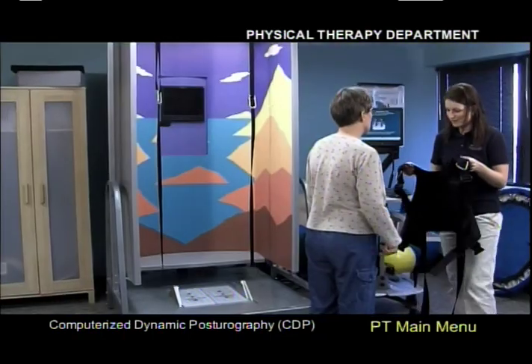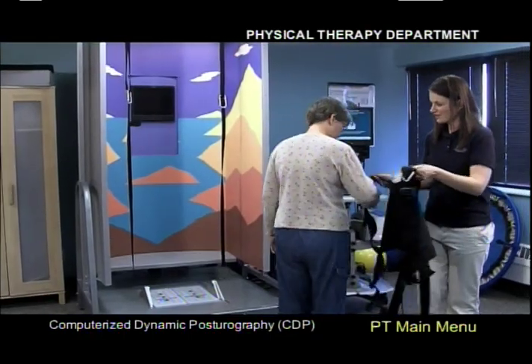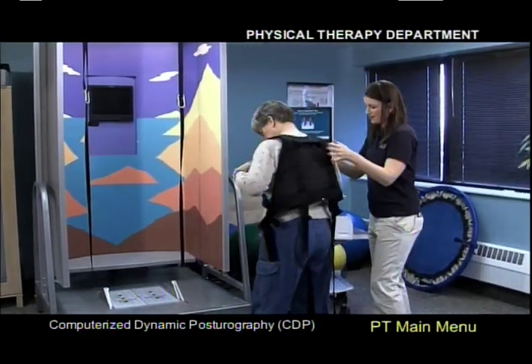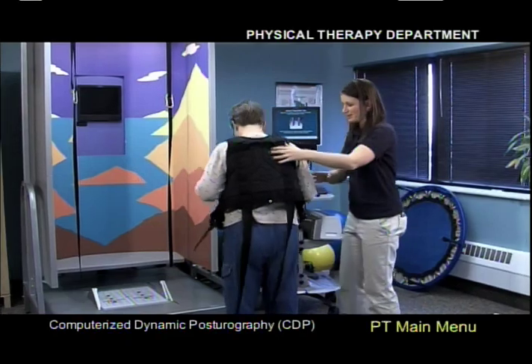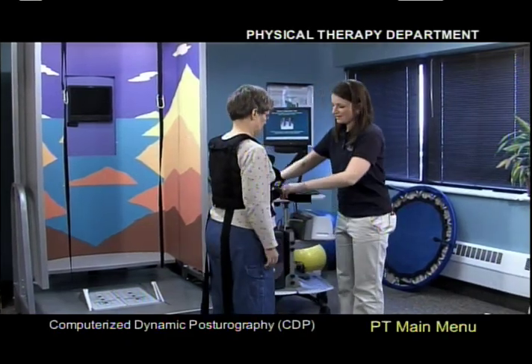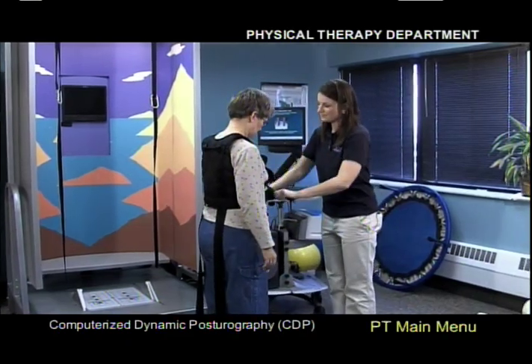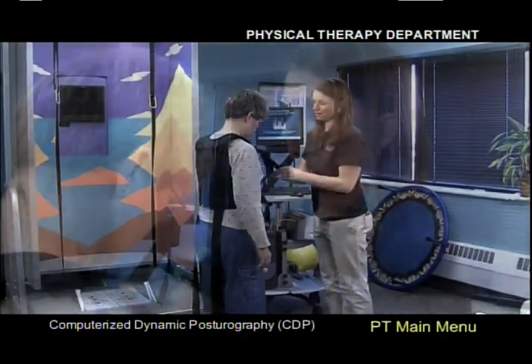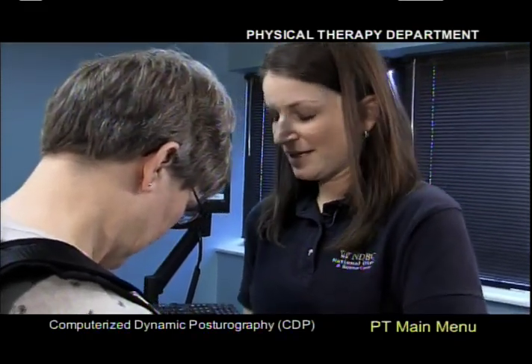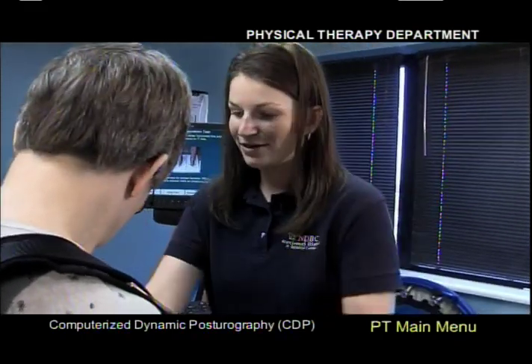During this test, the patient is asked to stand on the CDP platform without their shoes. For safety, the patient is harnessed in to prevent falls. The CDP consists of two tests: the sensory organization test and the motor control test.